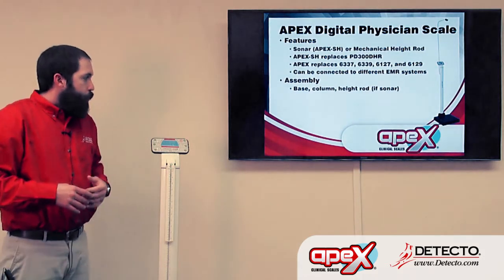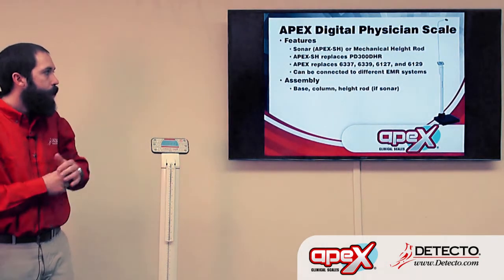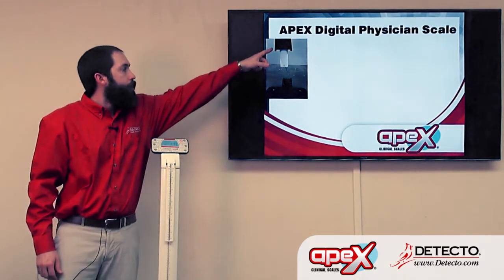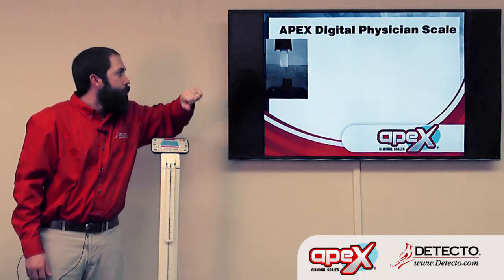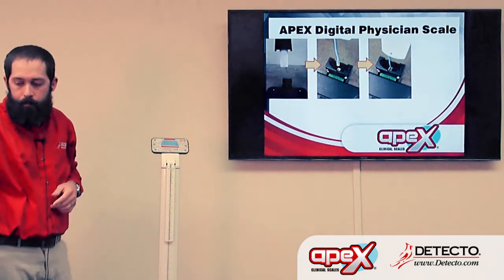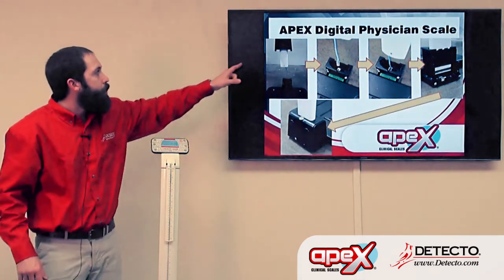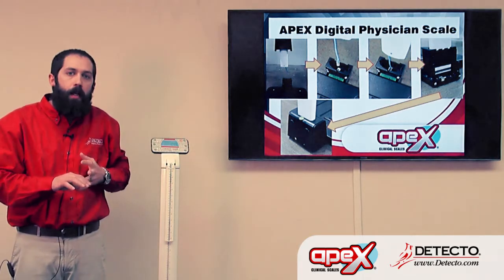As far as scale assembly, it's really the base, the column, and — if it's the Apex SH — a sonar height rod as well. To assemble, the column has a cable that comes out of the bottom of it. That cable gets plugged into the jack at the base of the column. Then the column sits down into the platform and gets set inside that socket. There are four screws that secure the column in place, and once all that's done, a black plastic cover from the top gets slid down and covers all of that up, so the only things exposed are a USB port and a power jack.